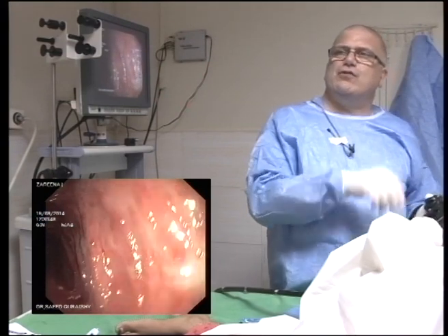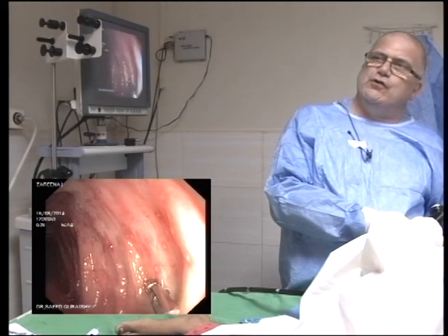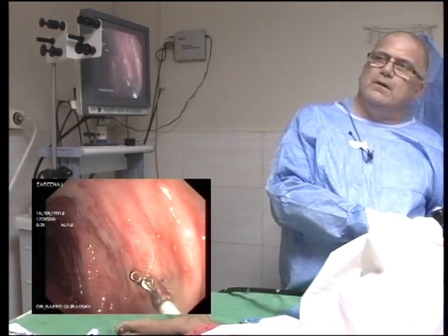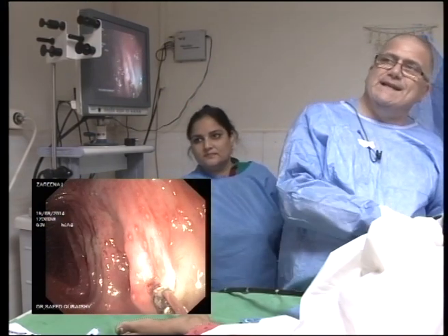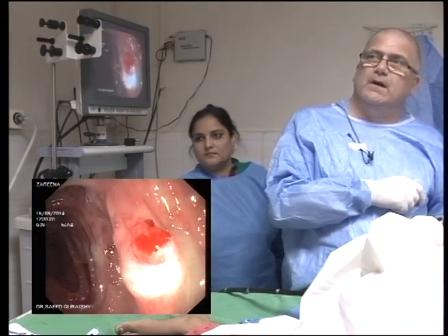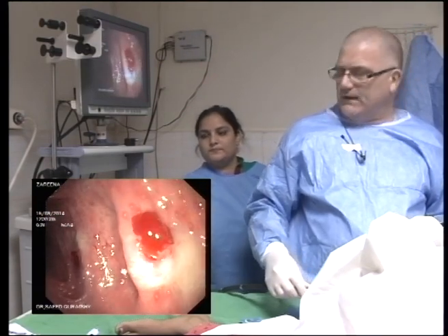Right, let me just show you what I tend to do on a biopsy. This is the most important thing. When you touch, open, close, pull, so it tents, then pull. So I slow everything down. That was slowed down immensely.